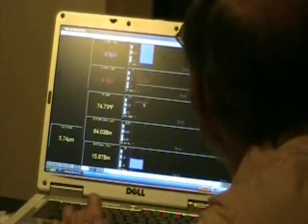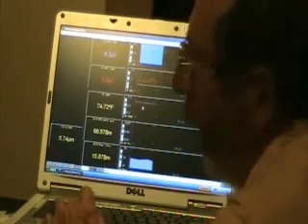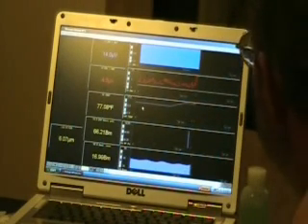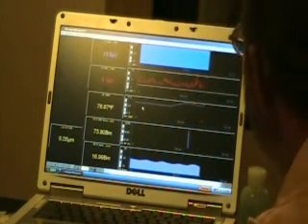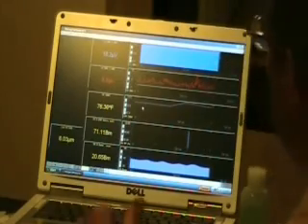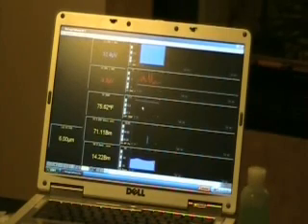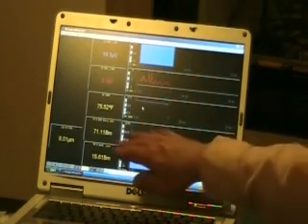So there's the signal. And now what I'm going to do is very gently press on this to trap some heat, and you see the signal going up immediately. So that's working fine. With GSR, which is shown out here, there's very little use looking at the raw signal. What we want to do is know whether it's reactive or not. We want to know if that number changes.